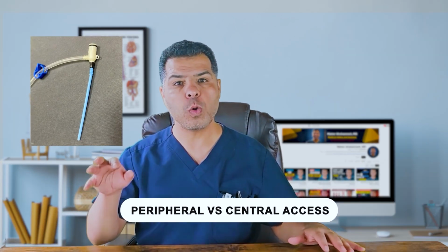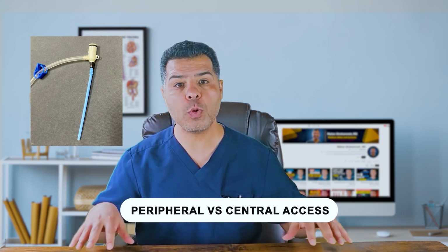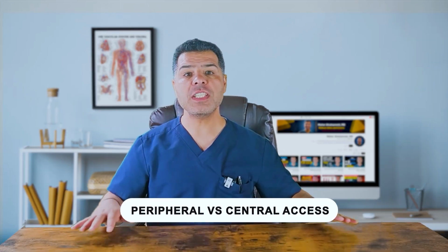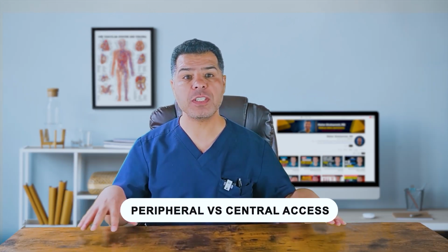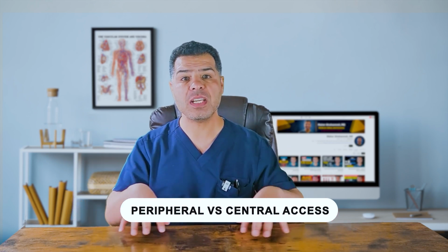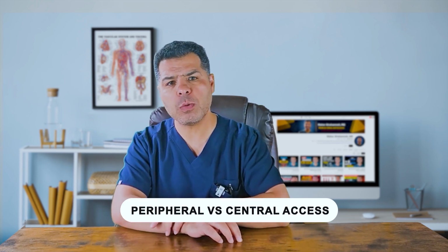Second, the Cordis, also called an introducer sheath. This is a short, large bore central line that provides rapid access to the central circulation. It is used when we need fast fluid resuscitation, multiple infusions, or placing a Swan-Ganz catheter in the ICU or the OR. Cordis lines are meant for very short-term use, usually hours to a few days.